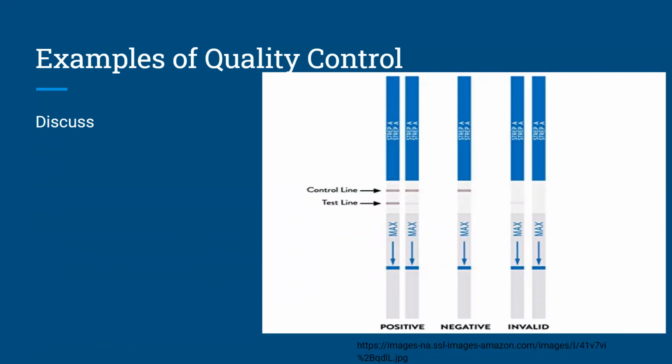And here again is a strep test with the same picture. Essentially, the first two strips are positive. This does indicate the weak positive. If a result is seen like this, where the positive line is weakly apparent, it's still a positive test. That indicates that although there is maybe not as much of the antigen that you're looking for as in the first test line, which is a darker color, it's also still a positive. And then of course the negative, there is nothing to see there in the test line. And then the last two are invalid, no control line, invalid test.